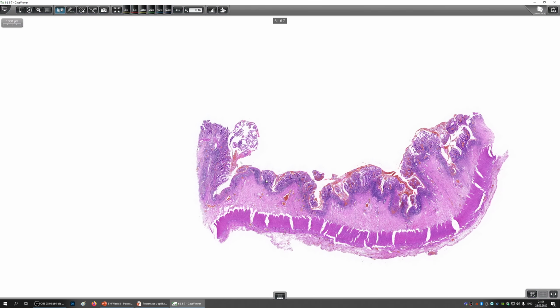But what I want to illustrate here are the so-called pseudopolyps. So what happens with ulcerative colitis is that some parts of the mucosa, like here, undergo atrophy. Like here, this is atrophic, and other parts of the mucosa, like here, this and this, they become hypertrophic. So you have atrophic and hypertrophic parts, and this gives the look of the mucosa.